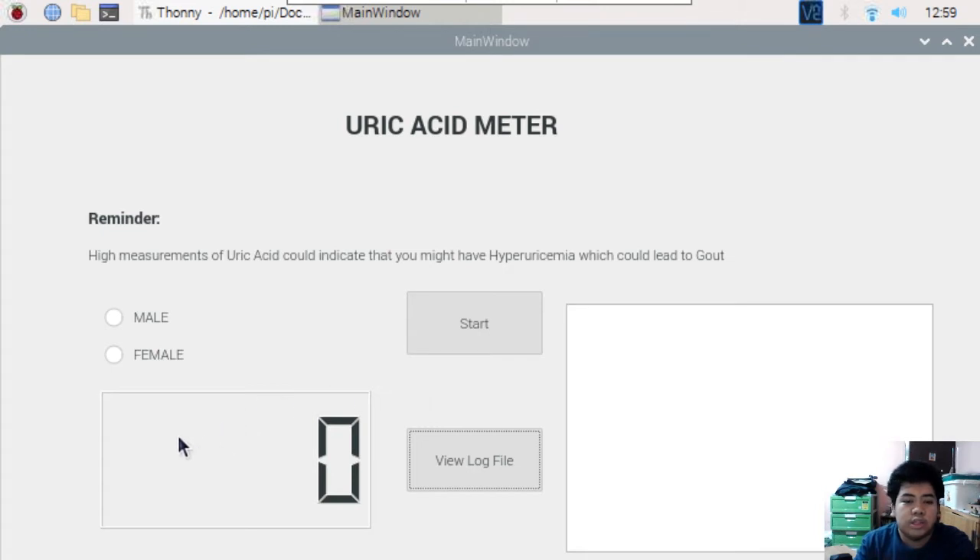There is an LCD display where the uric acid measurement will be displayed. Now we will take a few samples using the device.